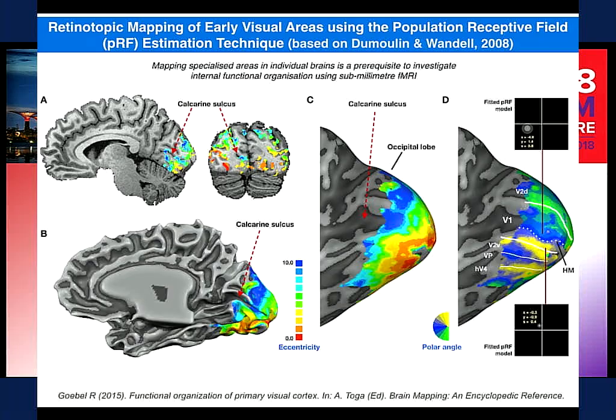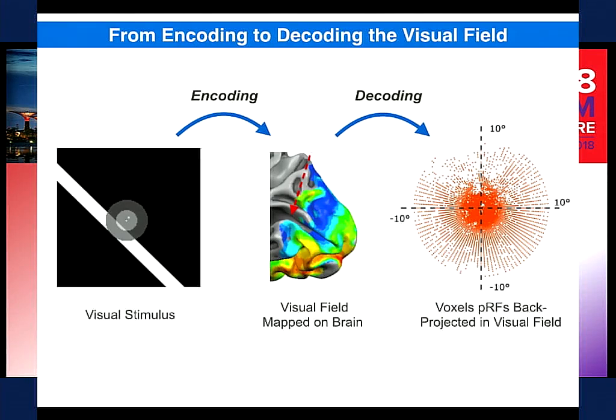So using that knowledge by using now functionally probed retinotopy, where we identify functionally the early visual areas, but also look how topographic information spreads inside these areas, like from foveal to periphery, for example, then we can use this very nicely to decode information. For example, in our case, we want to decode what's in the mind's eye of a person. So if a person imagines seeing a shape in front of himself, just mentally, it's not really shown, can we show to the person what he has in his mind, right, as a topographic image?